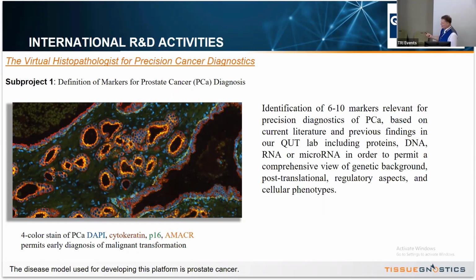While in flow cytometry or in spatial biology, I see we have a researcher here, you are used to having thousands of genetic markers on the same sample, with functional analysis we're still limited to, say, dozens in the best case. And these dozens can only be obtained by serial staining and not by simultaneous staining.